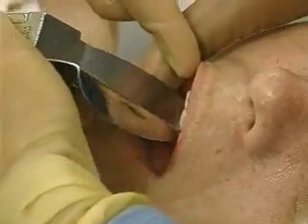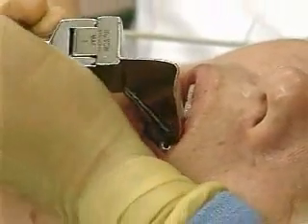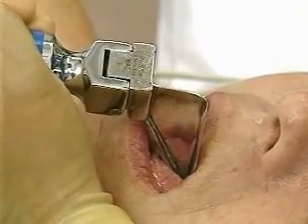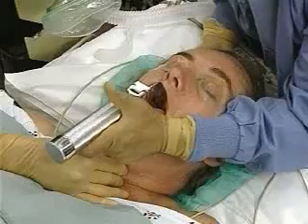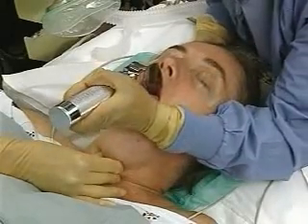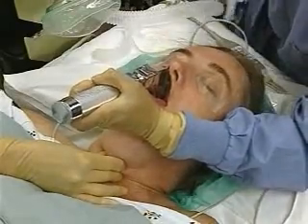Gently place the laryngoscope blade in the right side of the mouth, taking care to avoid damaging the teeth. Sweep the tongue to one side of the oral cavity while advancing the laryngoscope blade toward the glottis. Position the end of the blade under the epiglottis or in the vallecula, depending on the type of blade used. Avoid cocking the left wrist backward and levering the blade on the teeth. Lift the laryngoscope handle straight up until the vocal cords are visualized.